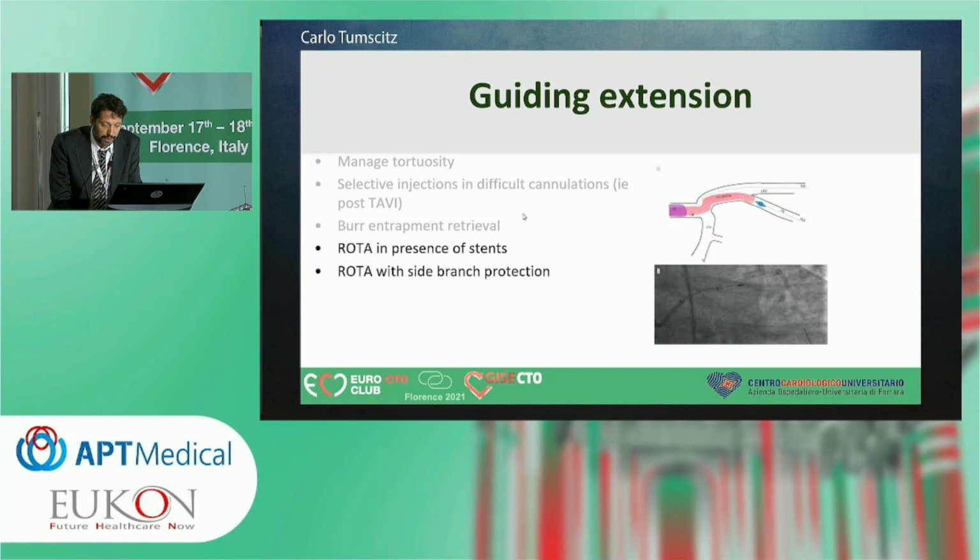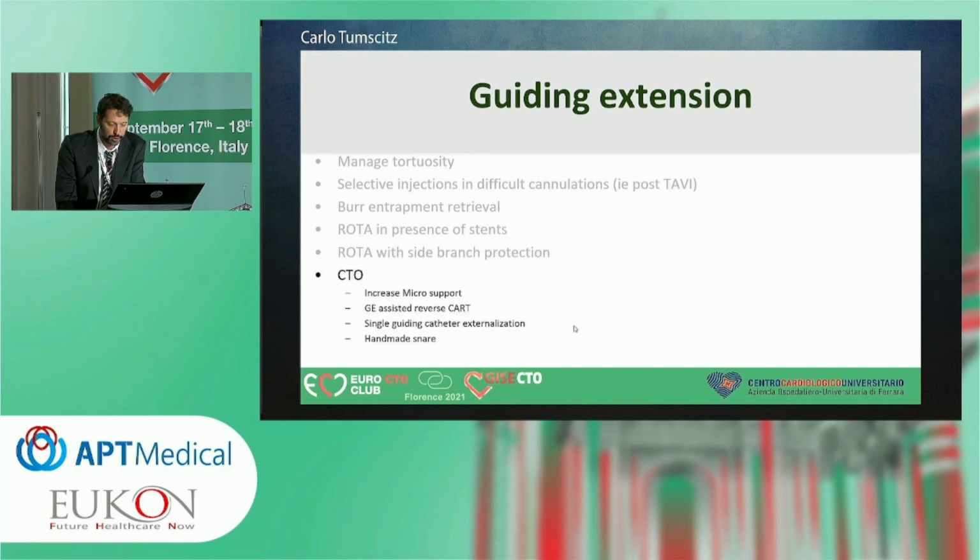And these are other very interesting techniques. Roberto knows it very well. It's a clever way to use it when we have to do rota with the bifurcation or where there are stents, and it's very, very useful. So I think everybody should know this.